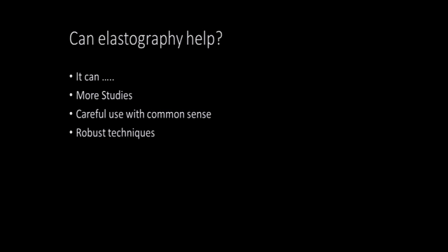So can elastography help? Yes, it can. Of course, more studies are needed, more prospective studies are needed. It is also prudent to use carefully with common sense in terms of how the images are acquired and recognizing artifacts as well. So robust techniques are needed with better guidelines and more experience, and that can help elastography help us with fine needle aspiration in the thyroid nodules.